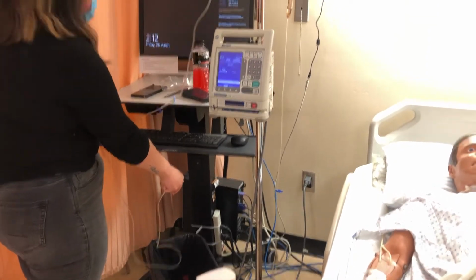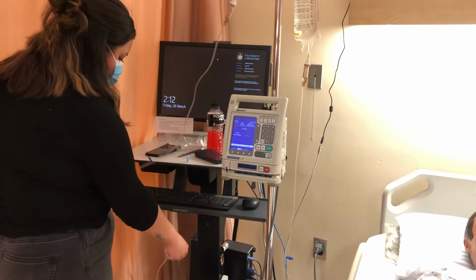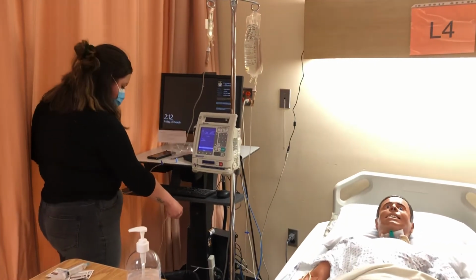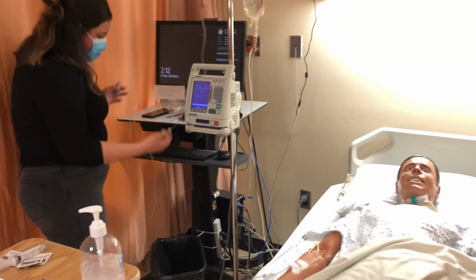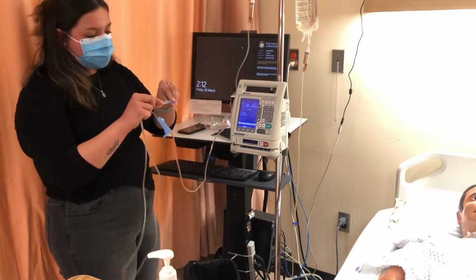Everything matches, so now I can combine my diluent and my medication. To start that, I will retract my... prime it, let it go away, being conscious not to lose too much insulin. That's the old saline that's coming out of this tubing. So it is now primed. There's no air in my line. I can recap this to keep it sterile.